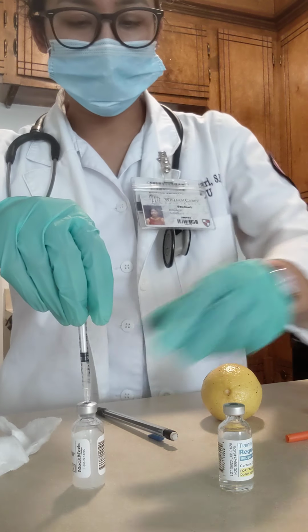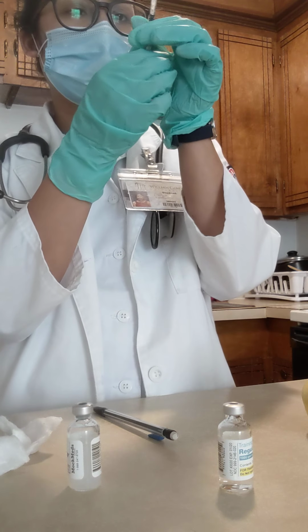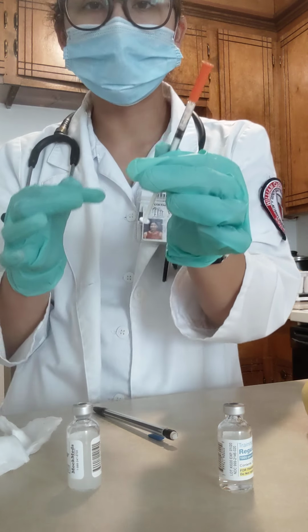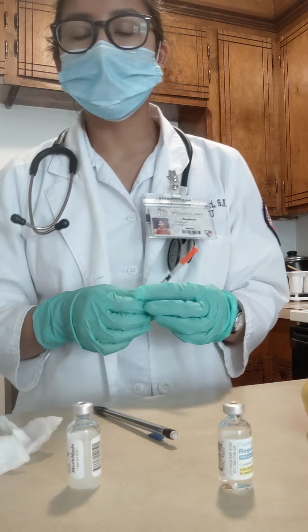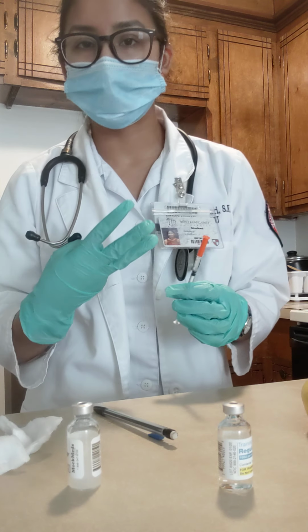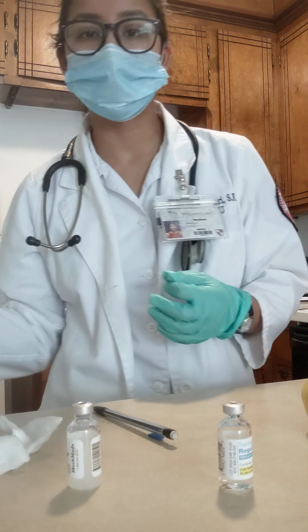Now I'll recap the needle so I don't prick myself. I'll make sure I have the correct dose, 22, and I got rid of the air bubbles. If I was outside my patient's room, I would have to label this syringe, but since I'm here with the patient, I'll do my third accuracy check at the bedside, and I'll verify the insulin dose, 22 units, with another nurse.